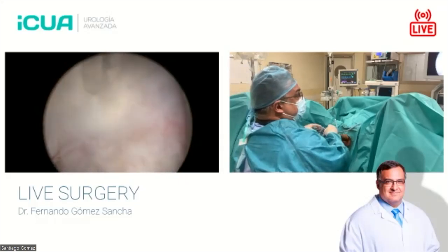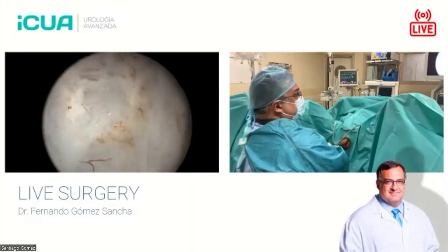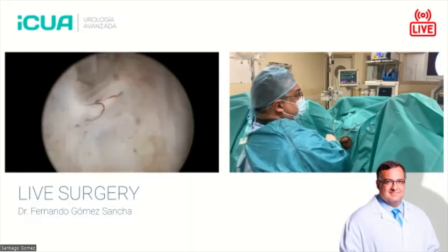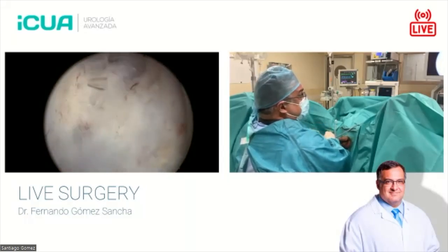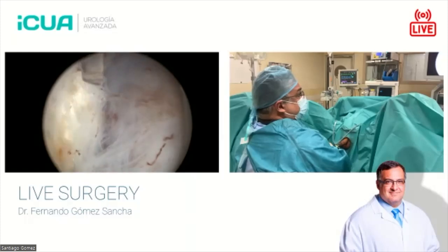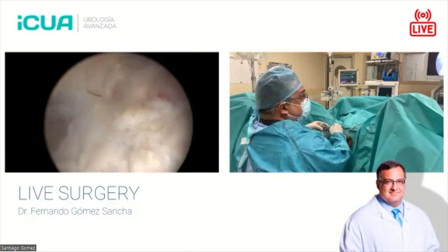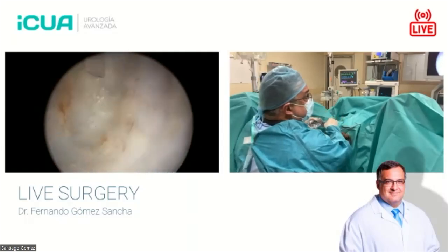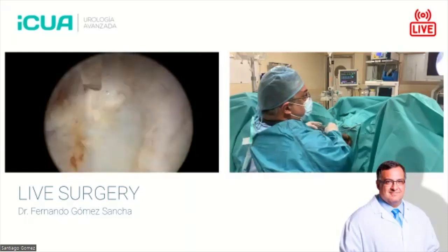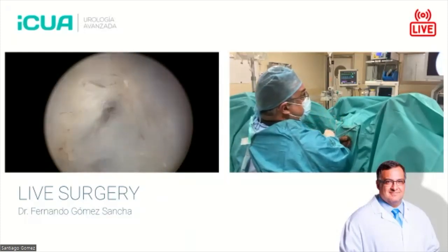There we are. Always you have to judge if the plane is correct or not, not only by seeing the beautiful plane, but also because we are able to distinguish some other characteristics. The capsule is more white. This is a little bit yellow, you see. So if you suspect that there is some yellow tissue, you can go deeper and try to take this tissue out and to correct your plane.